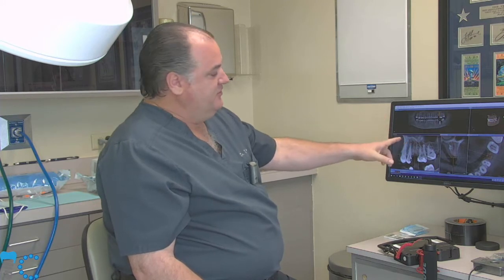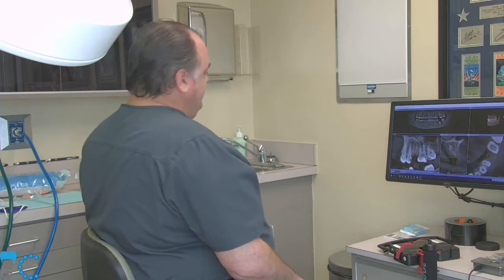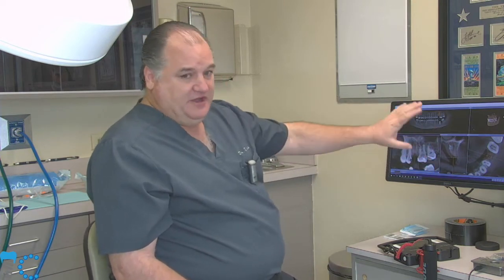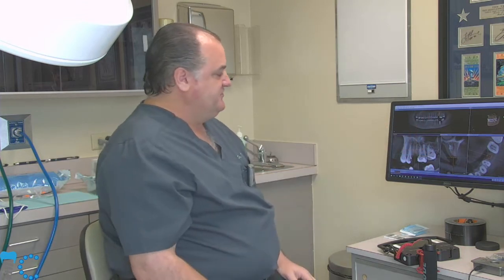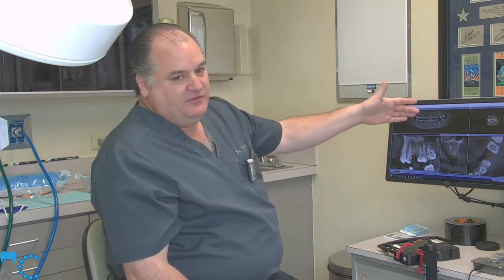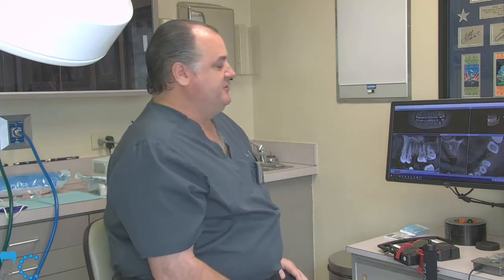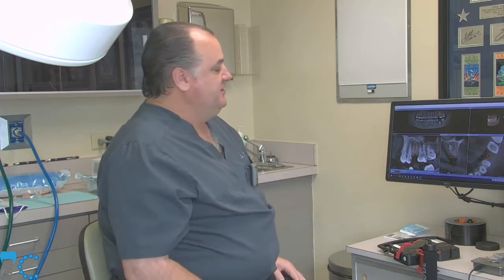And then the very last drill, whether we're placing a 4 millimeter diameter implant or a 5 millimeter diameter implant, we'll use the Z Systems drill, and without the surgical guide, just following the pre-drilled hole, and then we'll place the implant again with the surgical ratchet by Z Systems, again not using the surgical guide. So when we do guided surgery, we're using it for every step of the procedure up until the very last drill and placement of the implant itself. But we already have our implant position or osteotomy well positioned before we start doing any procedures without the guide.